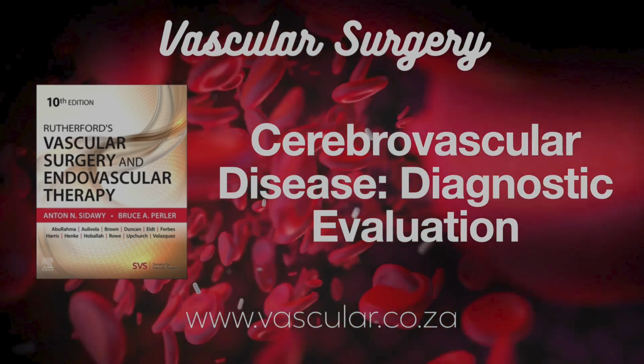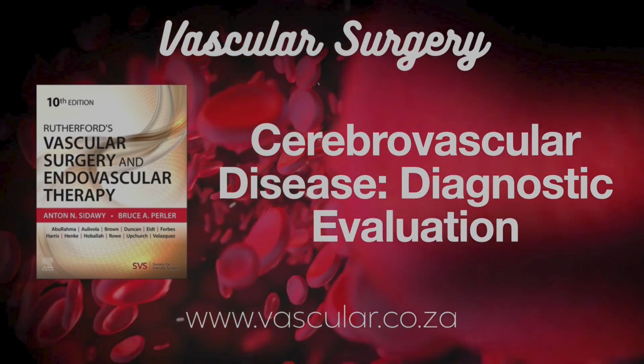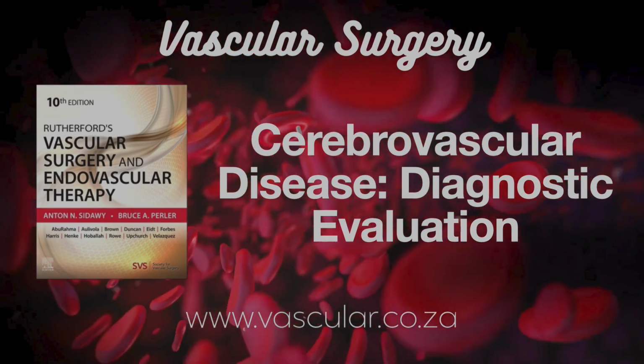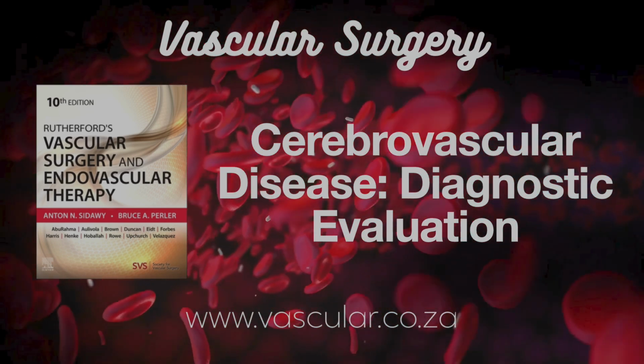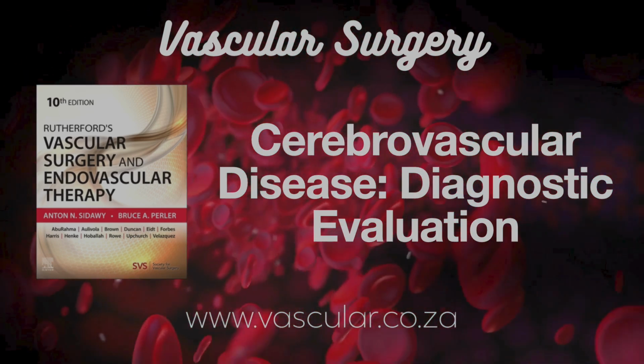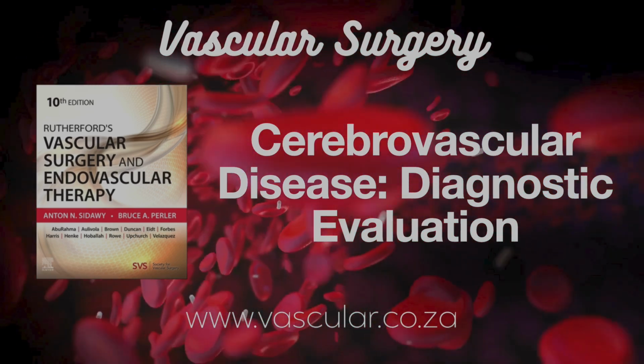Does DSA have a role? Limited role routinely, but sometimes for very large tumors, DSA is used just before surgery for embolization, deliberately blocking off the main arteries feeding the tumor to reduce bleeding during the operation. Okay, we've covered before and during.